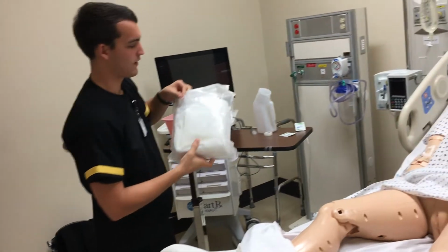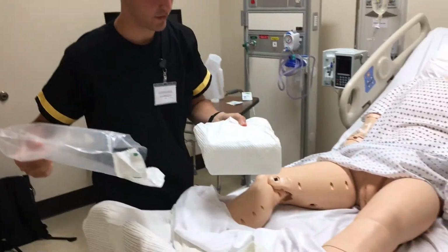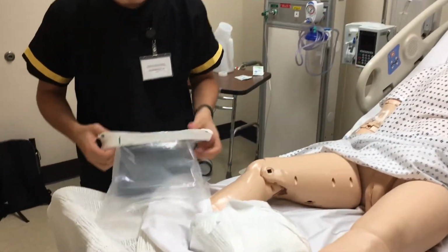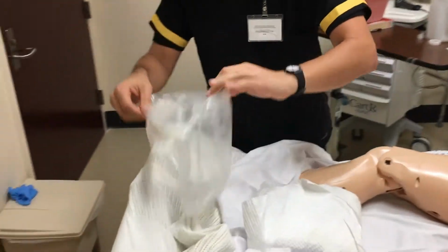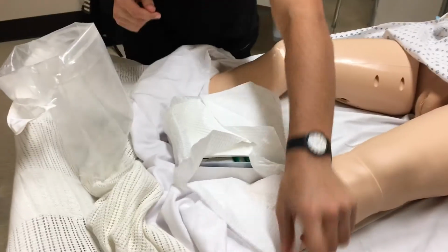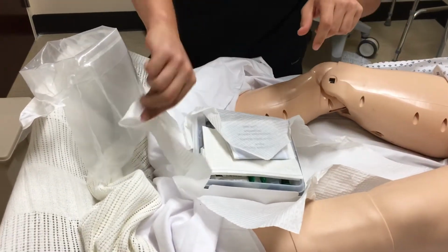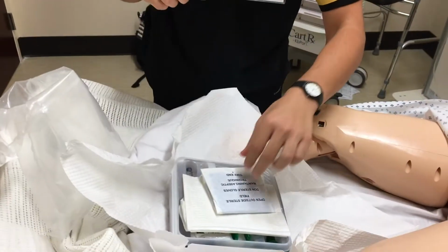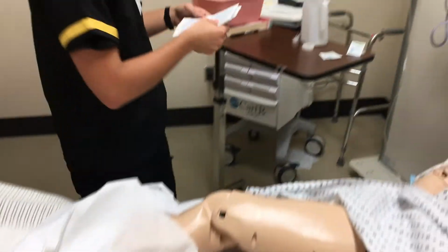My urinary catheter kit over here. I'm just going to set this right between your legs. Open this with some sterile technique. Now I'm going to put on these sterile gloves.